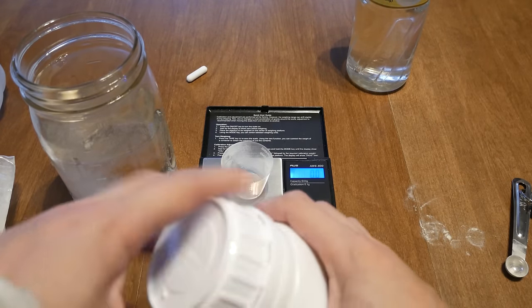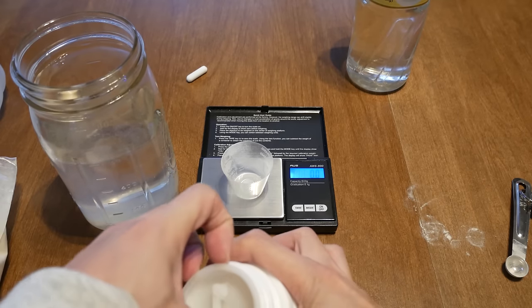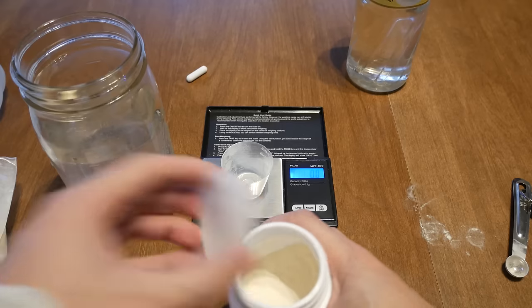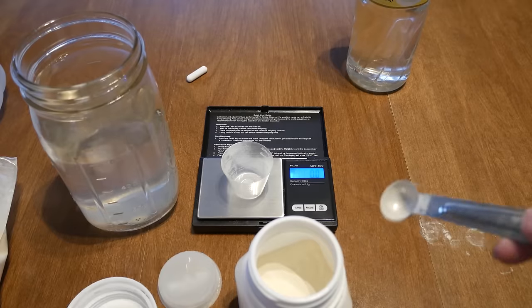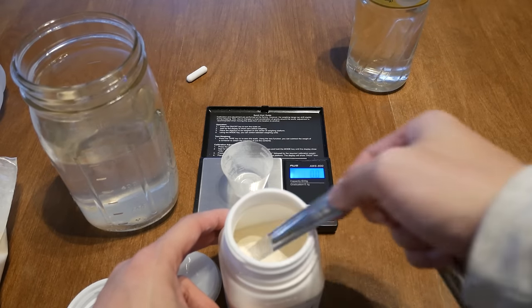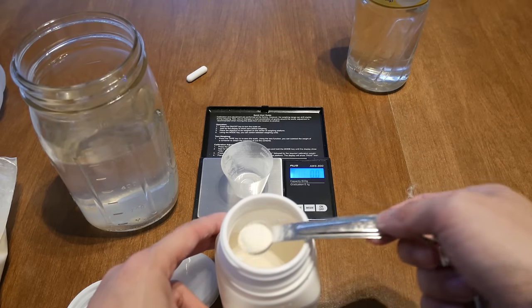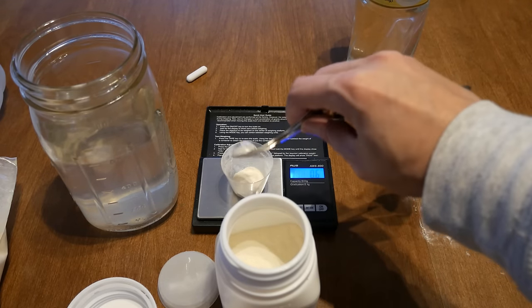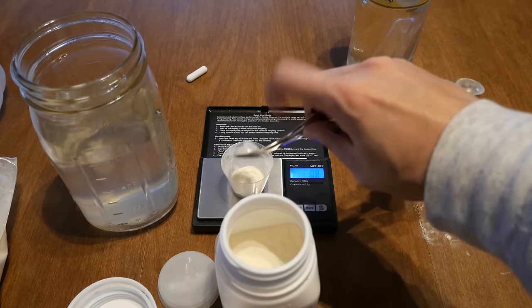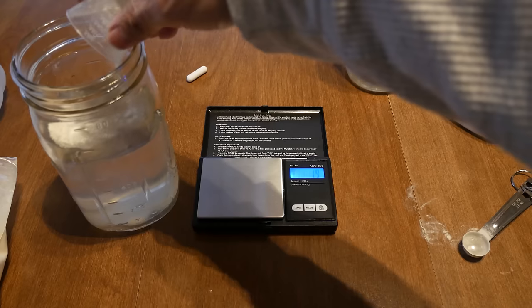And finally, we're going to measure out one gram of peptone — this is bacteriological peptone. This stuff is pretty light and fluffy. One gram of peptone is roughly half a teaspoon in volume. We'll dump that into the mixture as well.